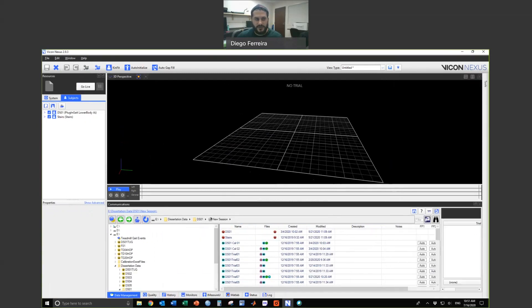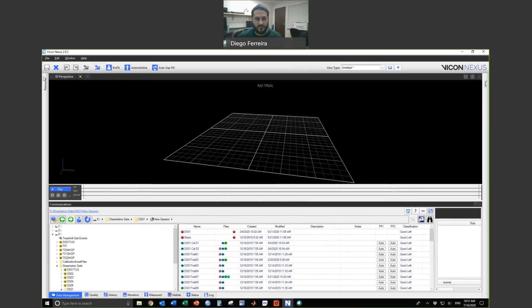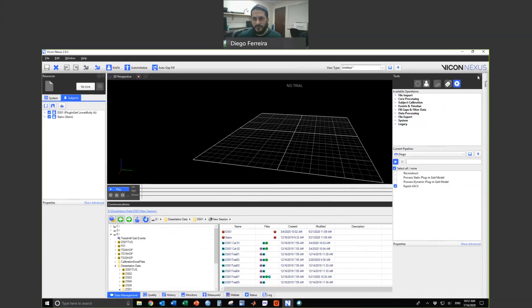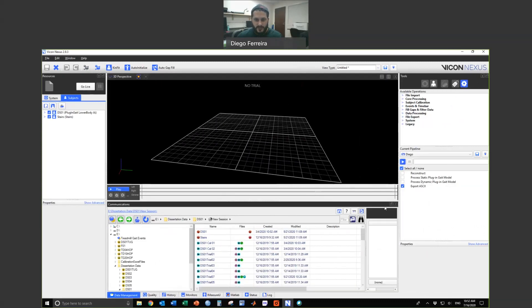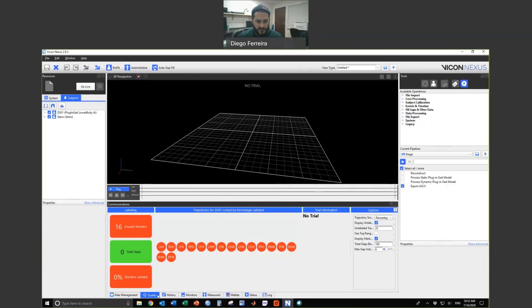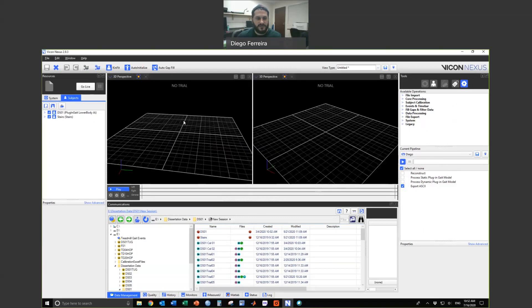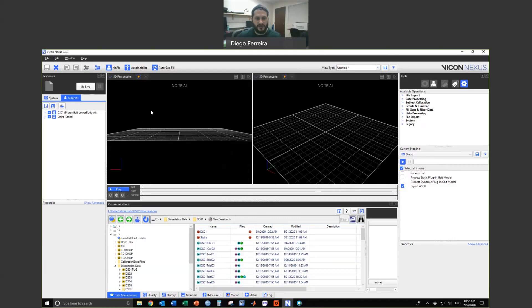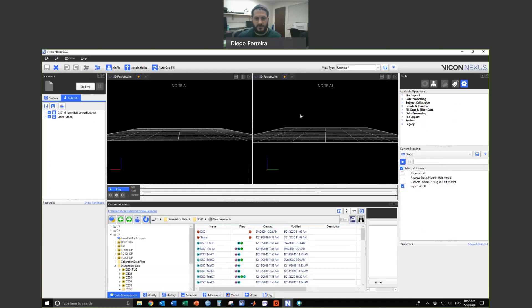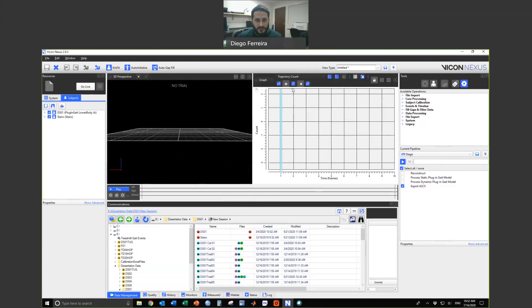I can do the same thing over here for the Tools to make the main screen as big as possible. There are also additional options down here — the Quality tab will come into play later when we're labeling. There's also the data management area where you can move and open files. You can add an additional viewing window, either side by side or top and bottom, which is useful when processing data — for example, a frontal view and a sagittal view, or pulling up a graph while processing.